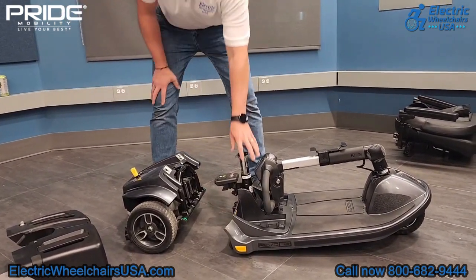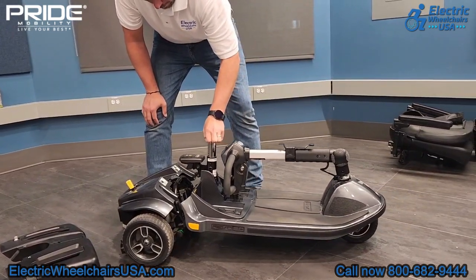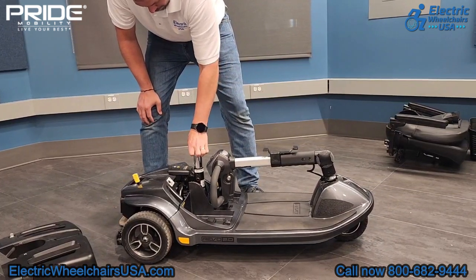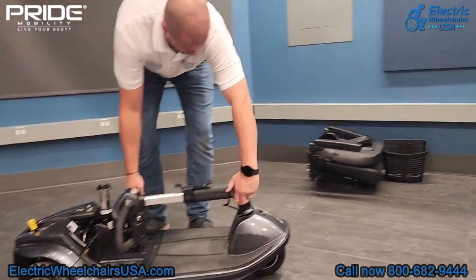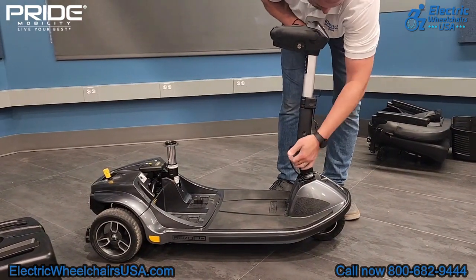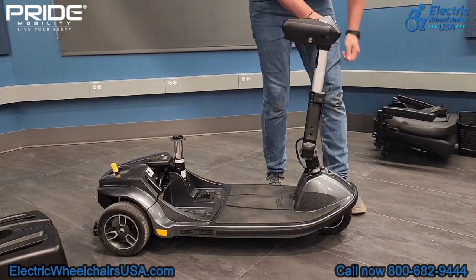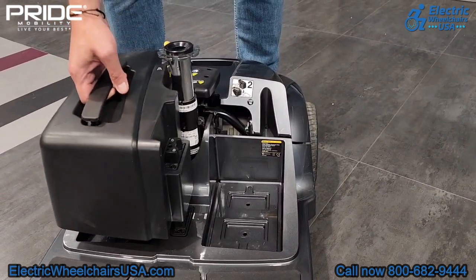First step is you would take the seat post, lift it up by that, and there's 2 hooks that are on the front half portion of the scooter. You want to line them up with the crossbar on the rear wheel assembly. And once you have those lined up, you just drop it and it'll snap right into place. After that, you would adjust the tiller up so it's into a comfortable driving position, and then you want to lock that into place. And then turn off the locking mechanism on the front wheel so that way you can actually steer the scooter. After that, you would put your batteries back onto the scooter.